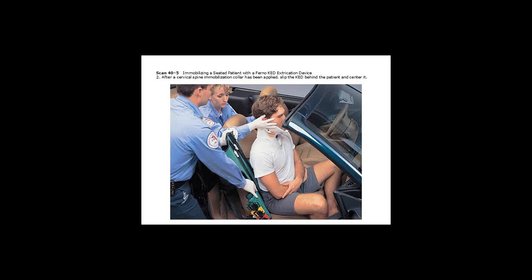Those little Velcro strips you see on the leg straps come back over the top side and Velcro onto the Velcro on the back, as we see up by the top handle. That is the correct way to store the device and the correct way to insert it. The reason is those leg straps are usually the biggest problem when using one of these KEDs — they get caught up or tangled. But if you have them appropriately stowed, once you get the device placed behind the patient, you release those leg straps and bring them down, one on either side, making it much easier to deal with.